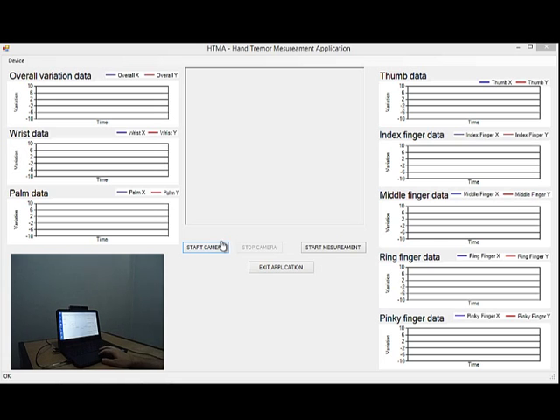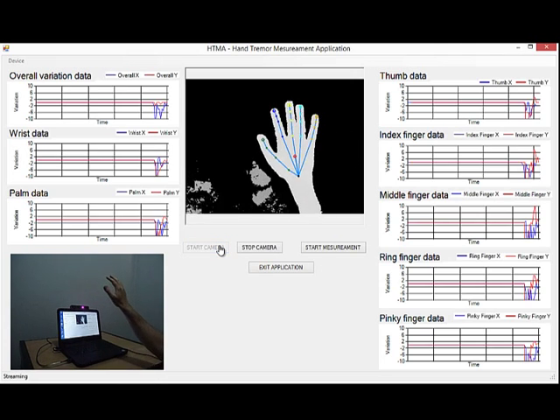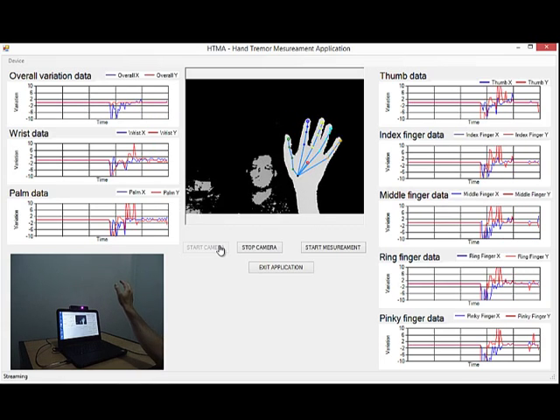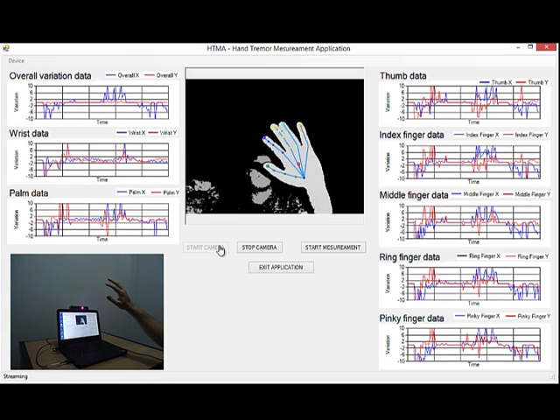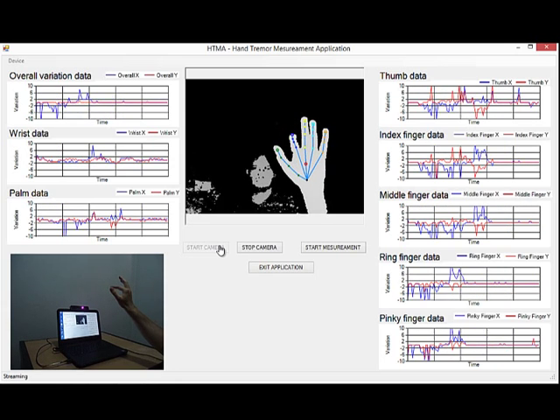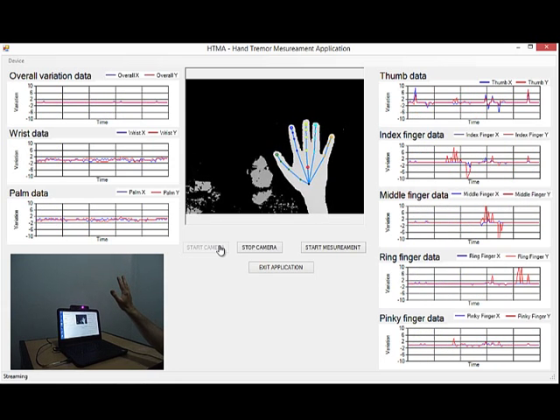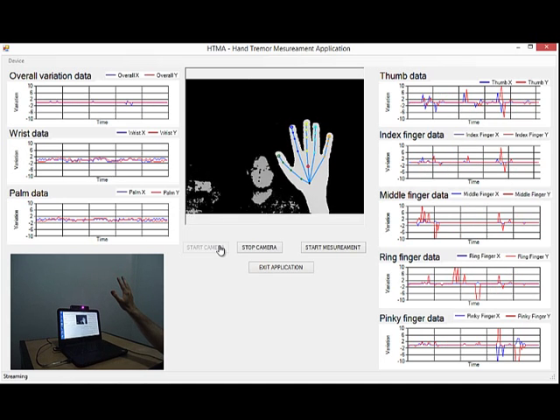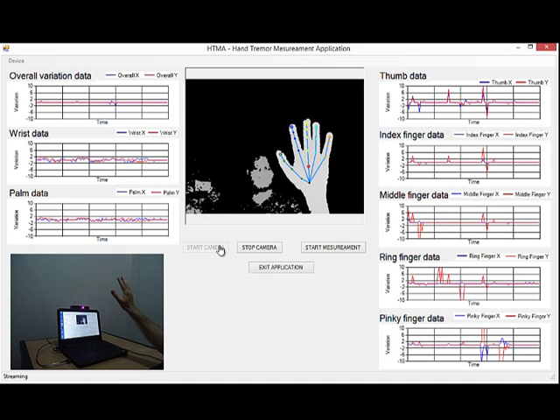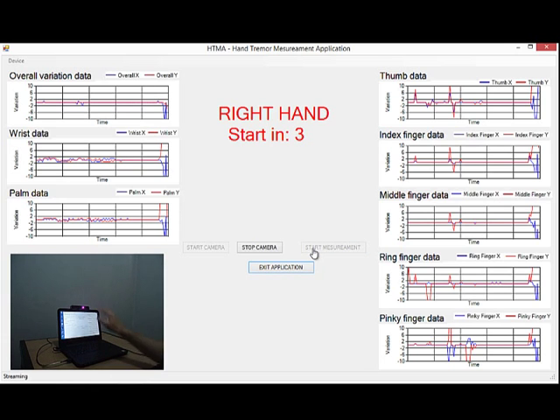Let's see a demonstration of the system. First, the user clicks on the Start Camera button to start the camera. Next, one hand must be moved in front of the camera to track the palm, wrist and fingers position. All the line graphs are updated in real time for each hand element as the user moves the hands and fingers. To start the measurement session, the user clicks the Start Measurement button.